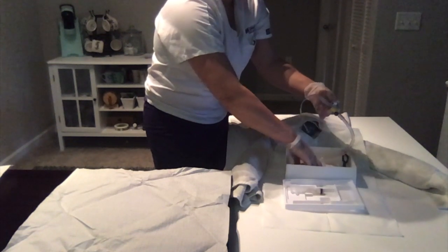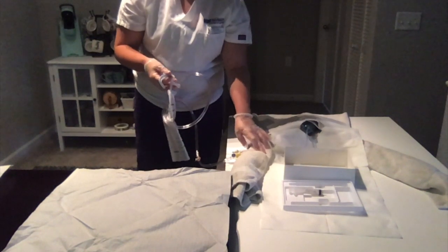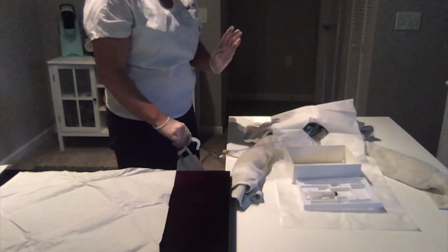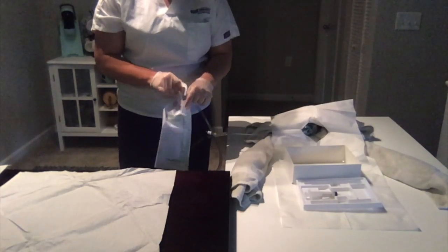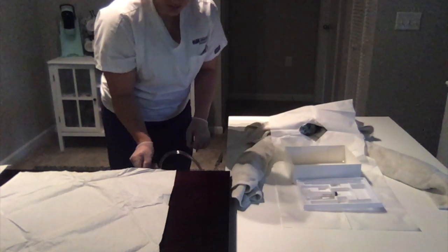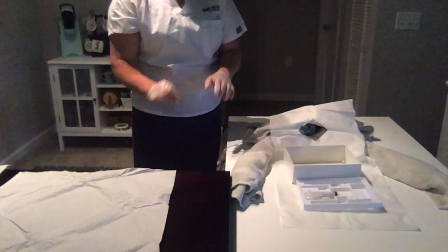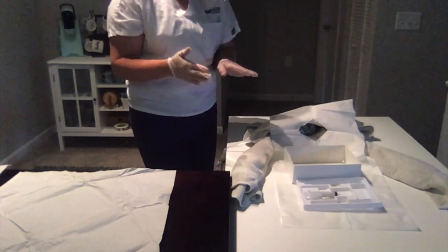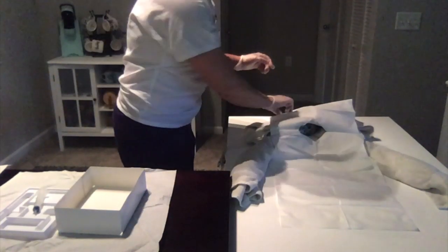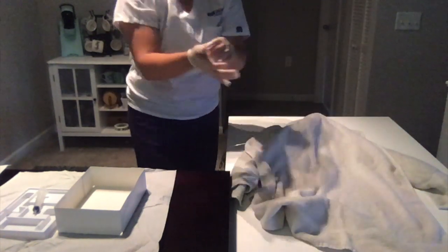So once I've done that, I'm going to take the bag and I'm going to put a clamp on her thigh, usually right here, if this were her thigh. It's the Foley catheter. I'm going to put the bag on the non-movable part of the bed below the patient's bladder. So make sure that it's not on the side rails or hooked onto anything like that. Once I have done that, I can go ahead and take all my trash and then take this off and go ahead and cover her back up.